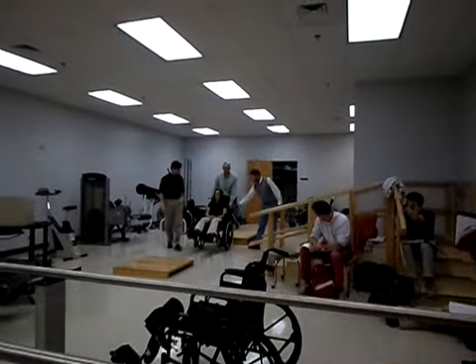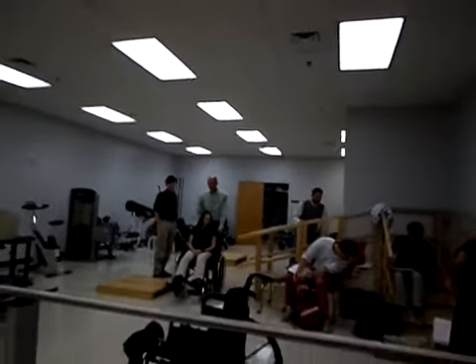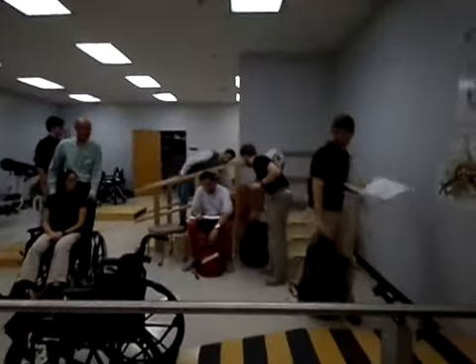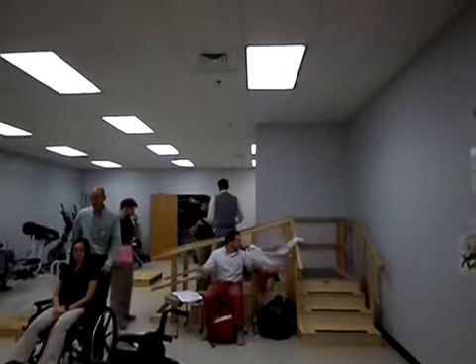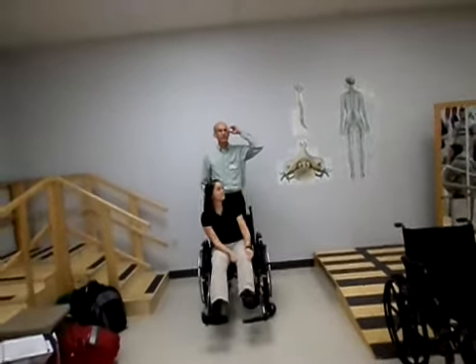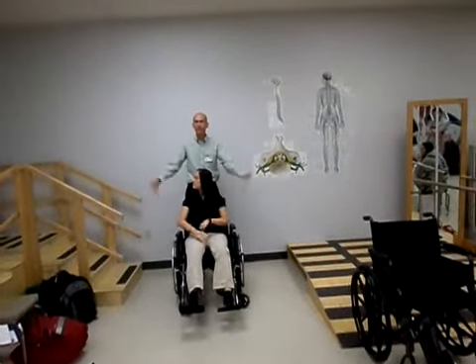Okay, now what we're going to do is the same thing on the stairs. So I need to get to the stairs over there, please. And you're going to do this outside on the steps in front of the building. So we need to clear all that out, please. Okay, so when you're doing this outside, I'll be out there too. In the front of the building, you're going to do it with 2 people helping. All right, so you have 1 person here and then 1 person on each side.